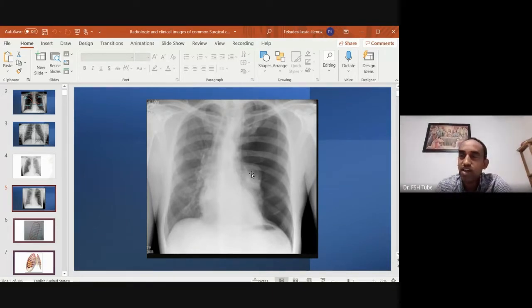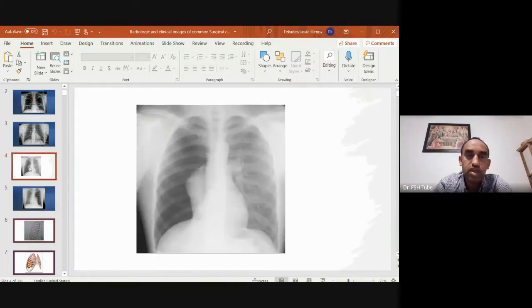The other thing is, in the previous X-ray, even though there is a very significant pneumothorax, we don't see any component of tension in this X-ray, right? And in that case, you have to think, am I dealing with an acute process or a chronic process? So most probably, what kind of process is this? Acute or chronic? Just say it, guys.